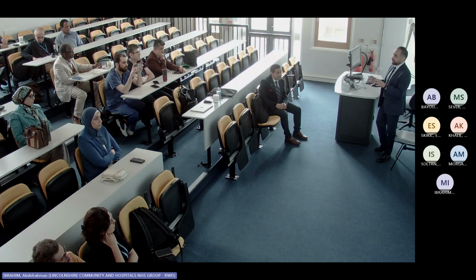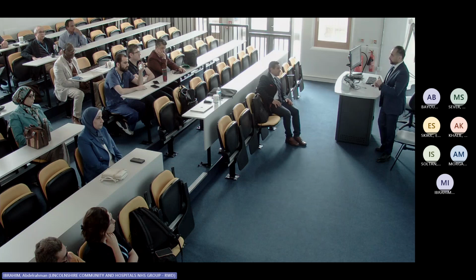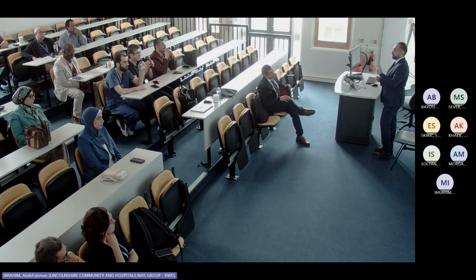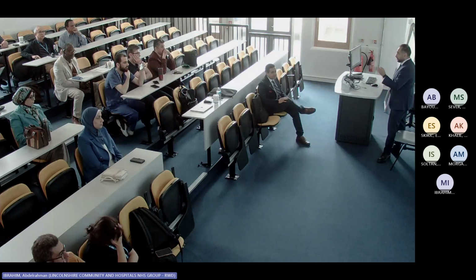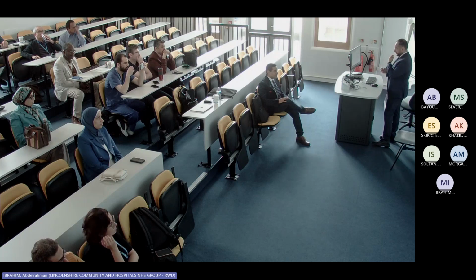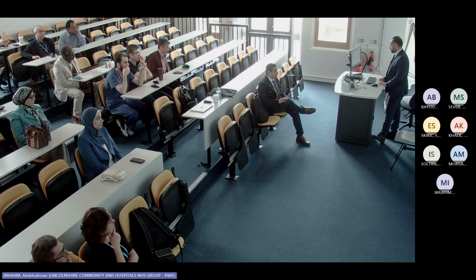Personally, in the last few years, I think that examining the eustachian tube orifice should be part of a normal pathology ear examination. If you have a patient who has any retraction, cholesteatoma, perforation, whatever, the eustachian tube problem could be playing the major role in why the patient is having a problem in their ears. It's very important to look at the eustachian tube orifice. And there is promising data in the literature that balloon dilatation has some sort of role.